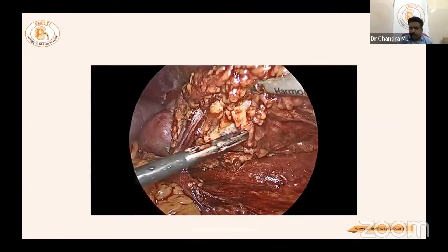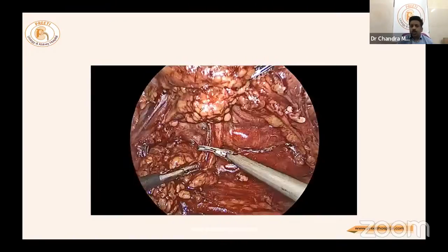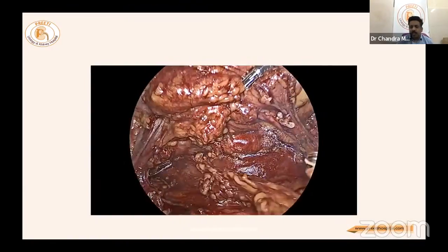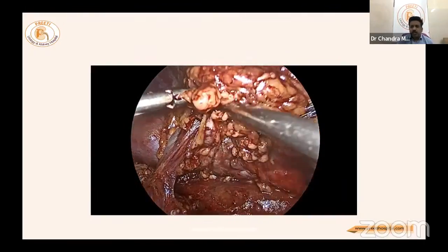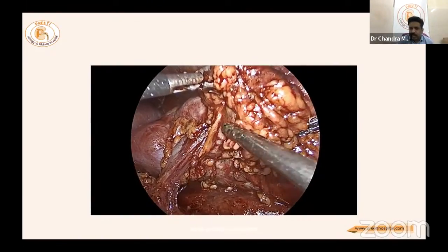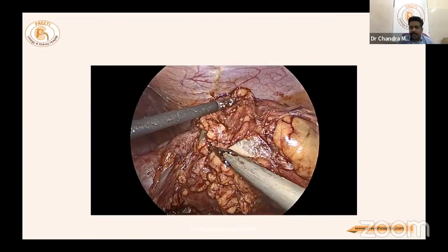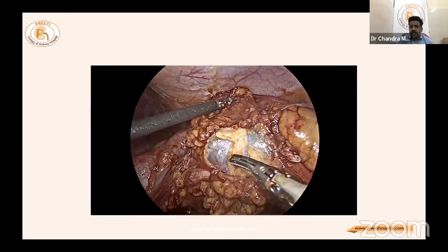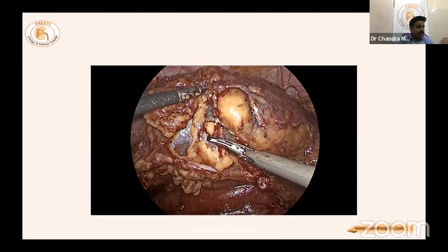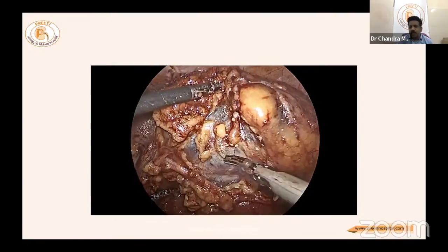Ureter can get devascularized, so go close to the kidney parenchymal surface, not close to the ureter — especially with harmonic, which transmits heat. Remove excessive fat carefully. Now the ureter and pelvis are visible, entering through Gerota's fascia. Careful identification of every structure is critical. At this stage, the most dangerous step is separating close to the kidney where the ureter can necrose — especially in benign conditions.